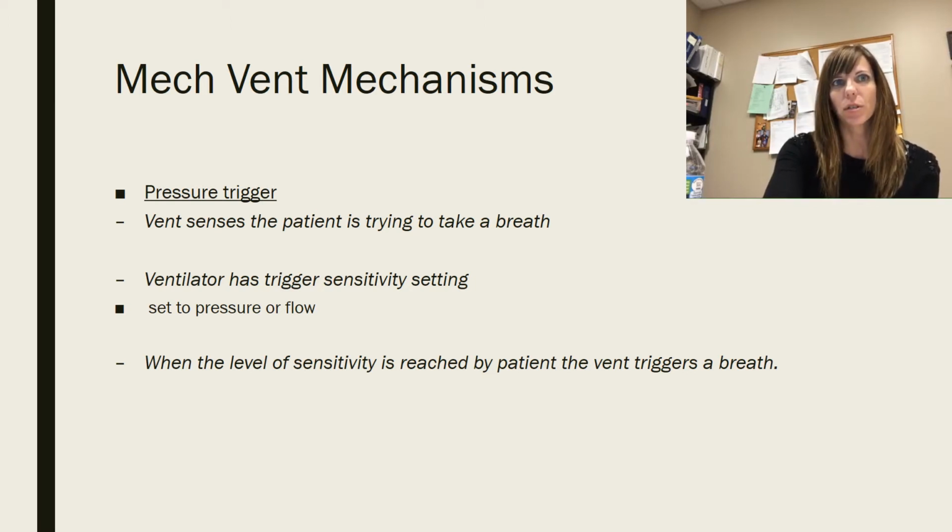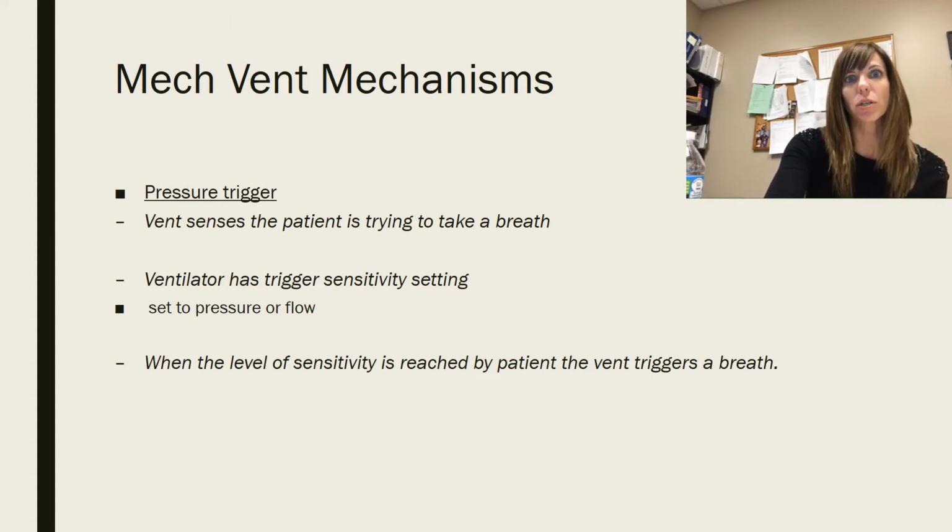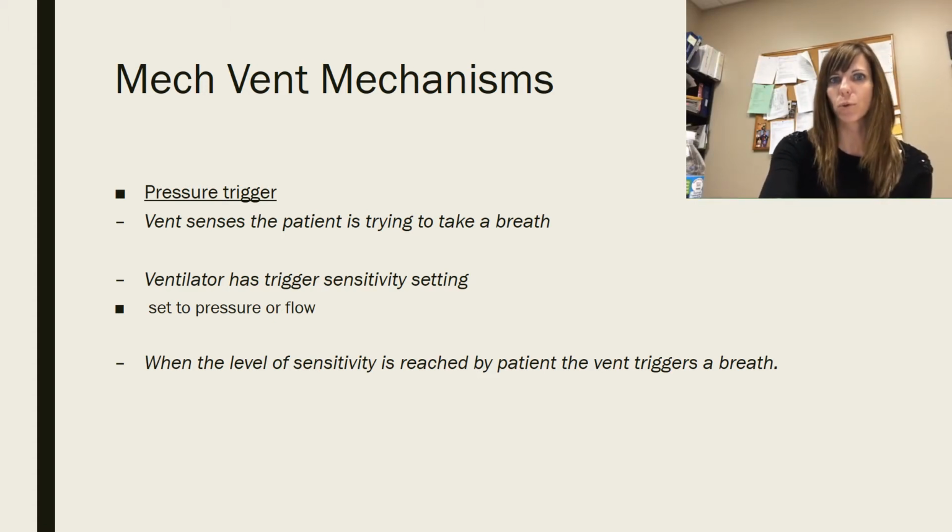Now, we've talked about patients being intubated, constipated, and sedated when they're on a vent. True, but we still want them awake enough to at least take a breath. If they don't, they're going to lose all muscle strength and it will take longer to get them off of a ventilator. So we need them to breathe on their own, spontaneously is what we call it. They're going to be breathing through the ET tube, but they're going to be taking a deep enough breath that the ventilator senses the patient's taking a breath, and then the breath will start.